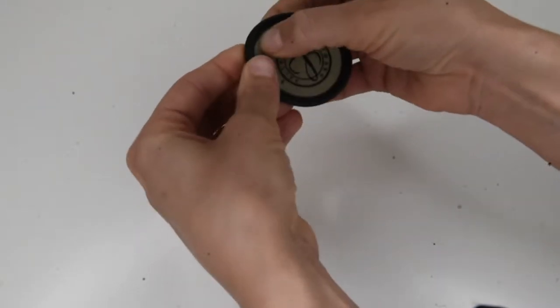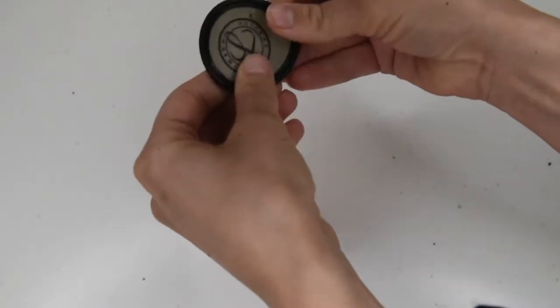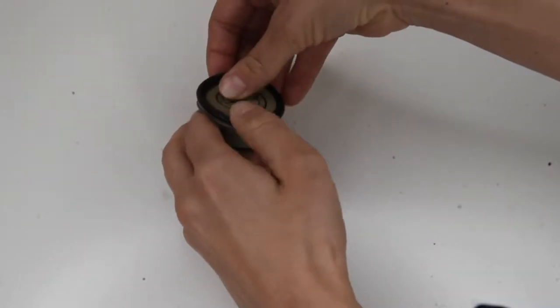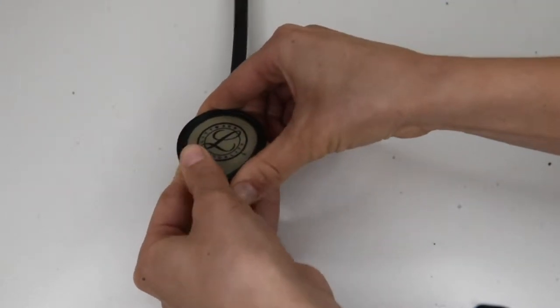Don't worry if the diaphragm comes off the border. You can easily put it back into place by just putting it into the groove, work your way around and snap it back into place. To put the diaphragm back onto the chest piece, you would simply put the diaphragm into the groove of the chest piece and then work your fingers all the way around and make sure it fits properly. You'll hear it snap into place and that's it.